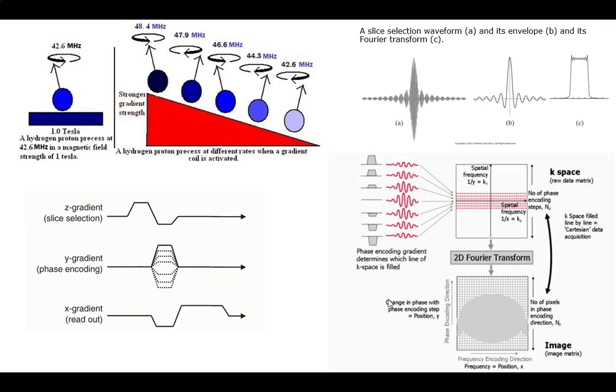It's called readout because we do it at readout time, right? And that will just change the Larmor frequency slightly down the X direction. So therefore that frequency differential will then show up in the read. And you're actually reading the whole thing at once. You just need a bunch of samples to get a good measurement of it. Does that kind of make sense in the basic ideas?